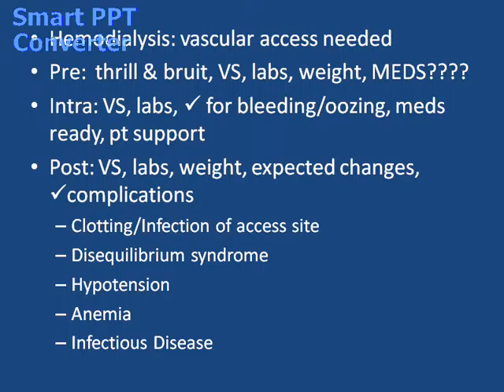Now, as our patients get older, there's a risk for access site complications related to chronic illness, fatigue, like real fragile little veins, and they just blow out a lot easier. So we want to make sure that we're using surgical aseptic technique during cannulation. No compression, I said that before. Any anticoagulants as needed. Always palpate for thrill and listen for the bruit. And look for signs and symptoms of infection, which would be redness, swelling, drainage, or monitor the patient for fever. And we're going to teach our patients all of these things as well.